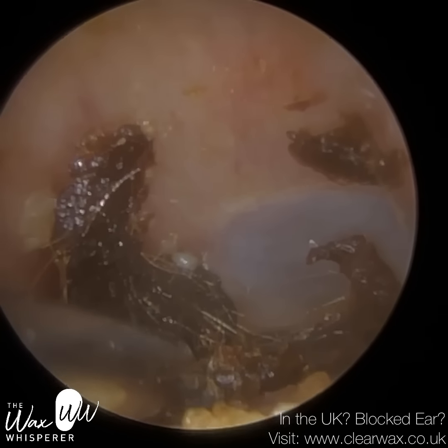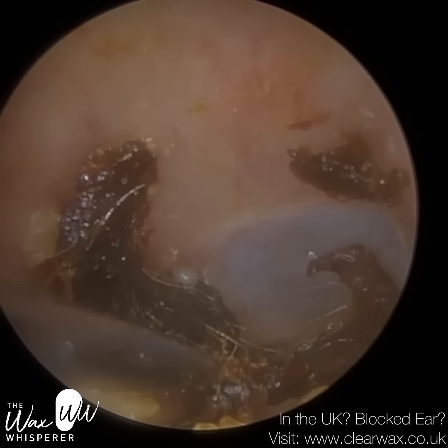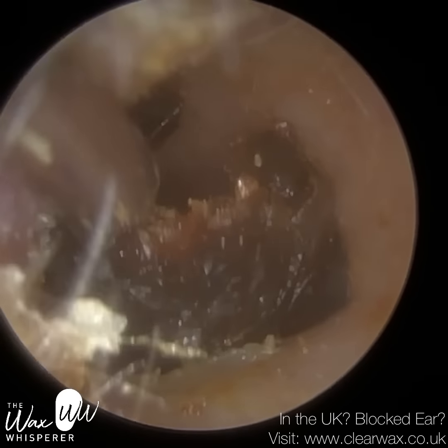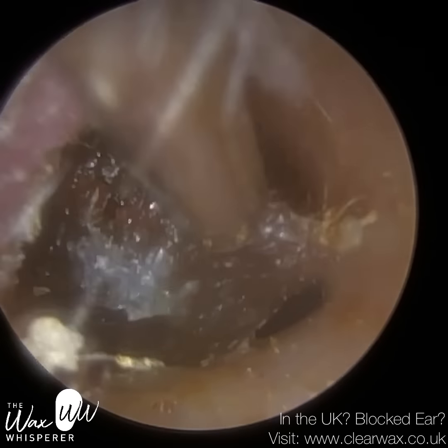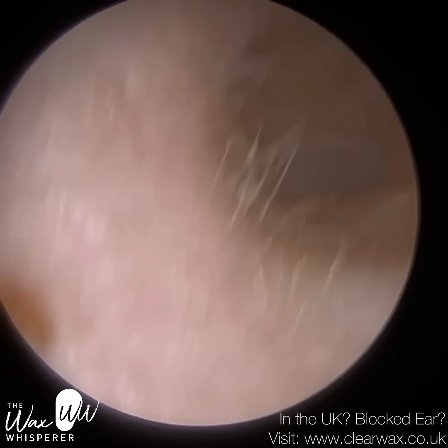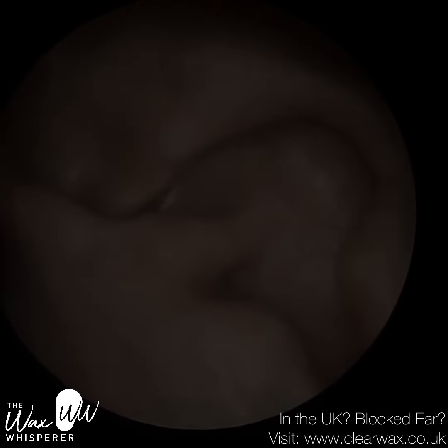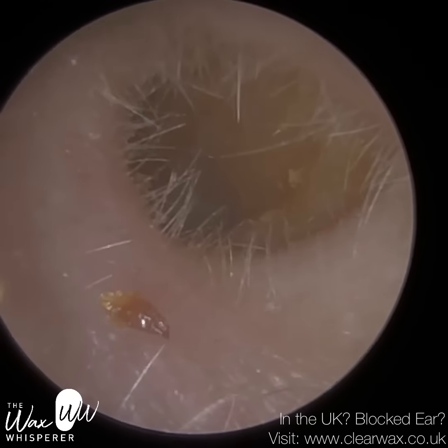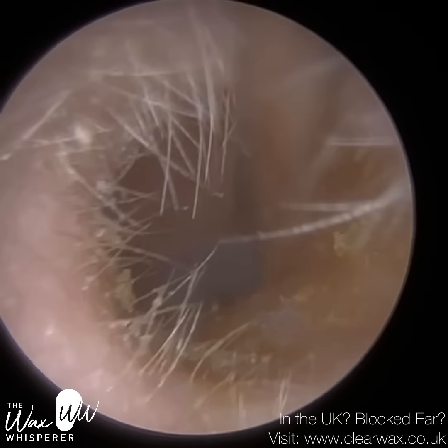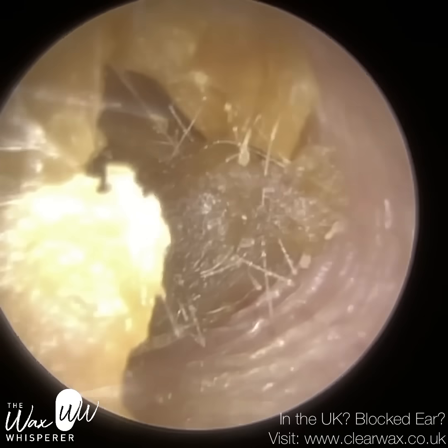So I just want to get a light suction grip. I don't want to push too hard, and I'm going to go from left to right, trying to detach it from the front part of the ear canal. There we are. I've just managed to tease it away, and now I'm going to extract it. And you'll see the wax here has taken the shape of the ear canal. It's come out semicircular, so it was almost like a little mould impression of the front part of the ear canal. So they have got quite a narrowing of the ear canal, an isthmus, and then they've got quite a widening beyond that. And because the wax was trapped in that widened part of the ear canal towards the eardrum, I was having to bring it through the narrow part of the ear canal, the isthmus, which is always difficult.